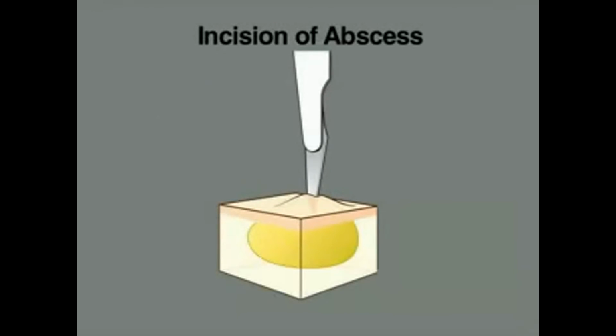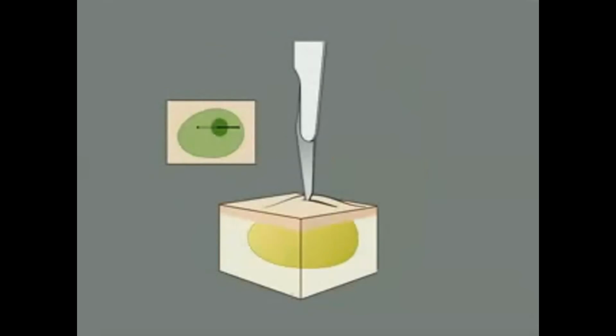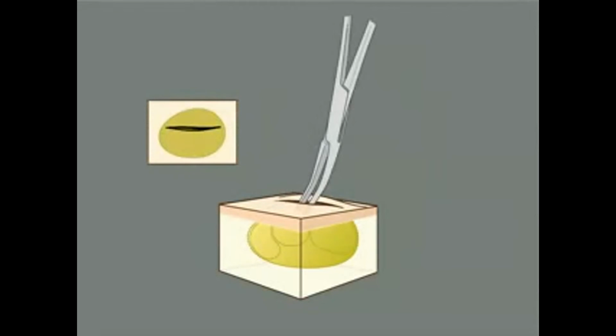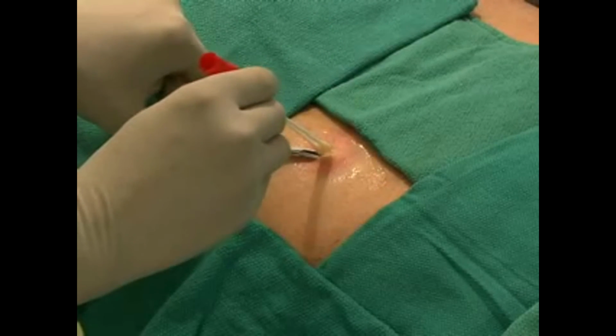Care must be taken to control the scalpel during the stab incision to prevent puncturing through the back wall of the abscess. The goal is to allow enough access for introduction of a hemostat to break up loculations and place internal packing. Use a swab to obtain a sample from the interior of the cavity for bacterial culture.